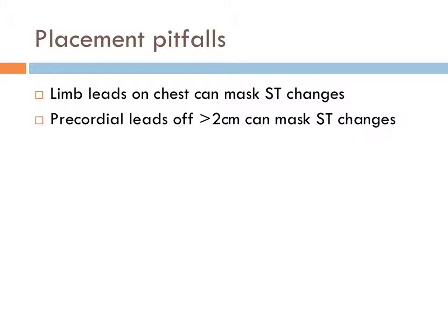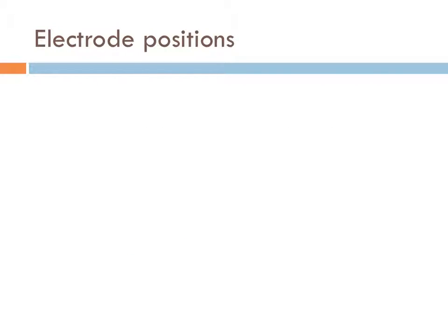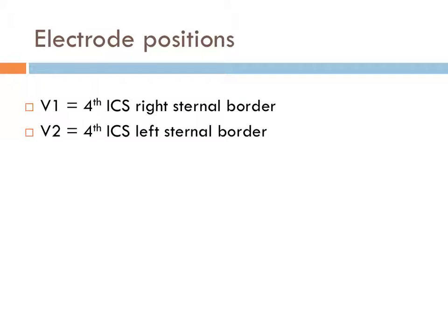And also the precordial leads, if they're off by more than 2 centimeters, about slightly less than an inch, can create or mask ST segment changes. So what I'm getting at here is that accuracy in your lead placement absolutely counts. So where do we put our leads? V1 and V2, fourth intercostal space on either side of the sternum.